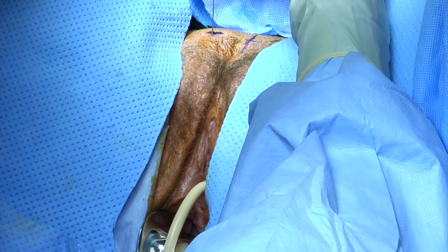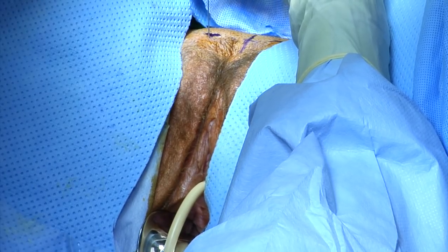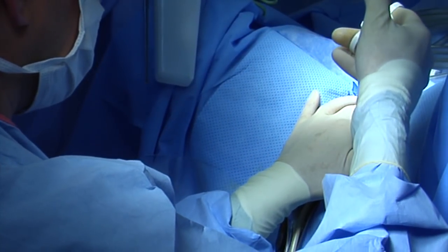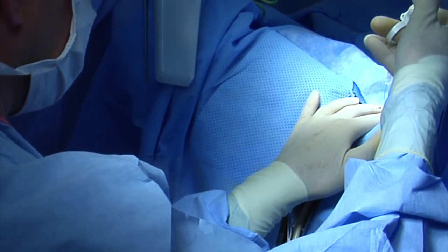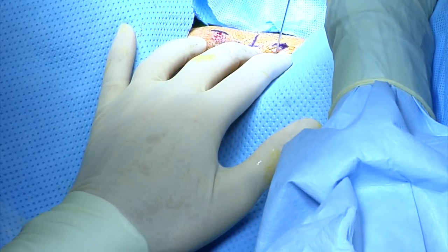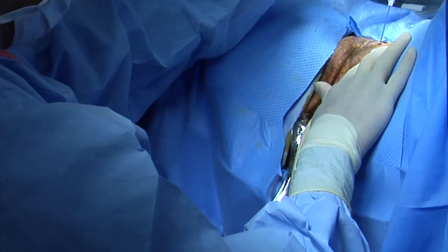Start at the needle exit sites and pass an 18-gauge spinal needle along the back of the pubic symphysis until the needle touches the endopelvic fascia. Back the needle off the fascia roughly 1 to 2 centimeters. Inject 30 to 50 cc's local anesthesia on each side. Ensure the needle tip passes behind the pubis and into the rectus sheath.